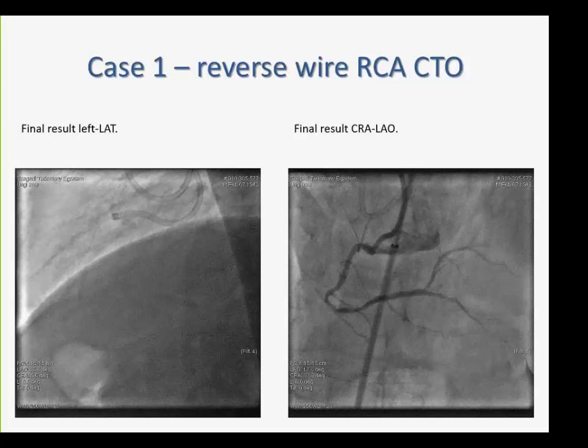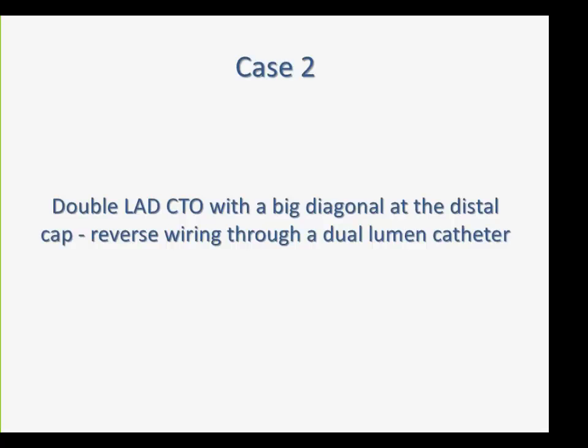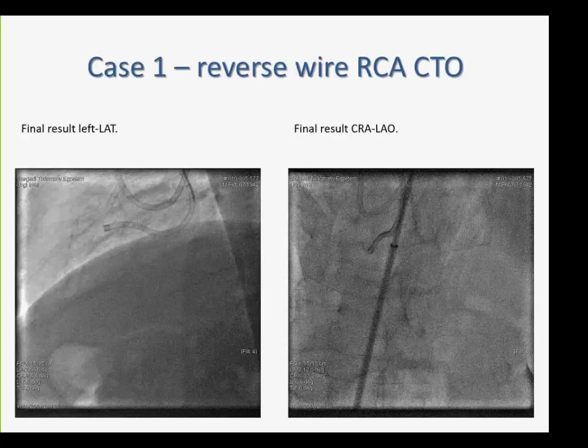Perfect. And then, Imre, one quick question. So did you try first to wire through the Twin Pass without the hairpin, or you tried right away with the hairpin? Yes, we tried to do it with the conventional, with the regular use.